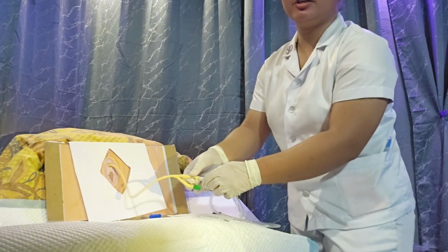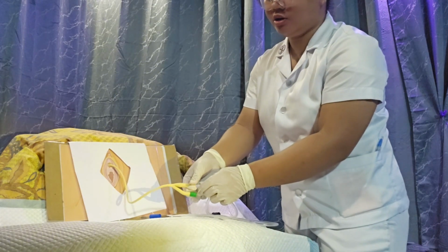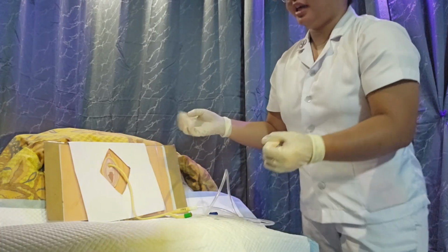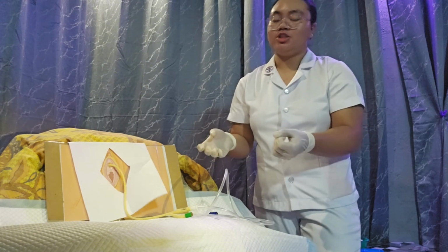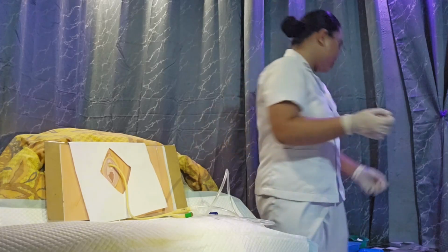So after connecting the urine bag to the catheter, we are now also going to wipe off the excess antiseptic or lubricant from the patient's genital area to avoid any skin irritation or skin breakdown.